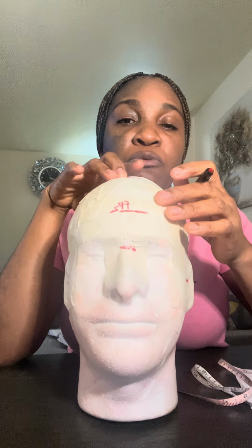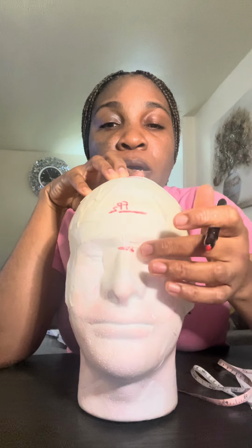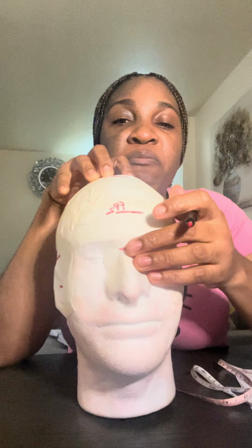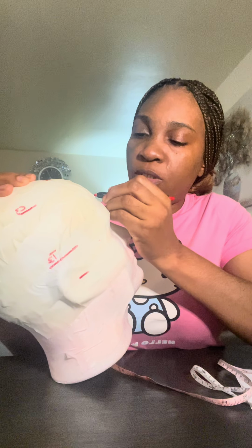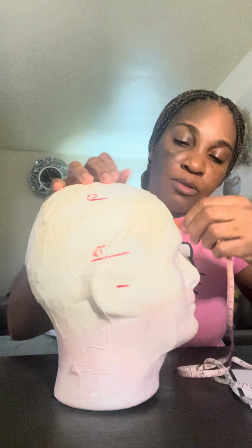Now the next measurement is going to be my circumference. Before I start with my circumference, I have to make a true line on my FPZ, looking from my nasal, the indentation between the two eyebrows, going straight up will give me my true mark for my FPZ. So I'm going to be doing that now. Okay, so this is my true mark. I'm going to place my 0 mark on it to measure my circumference.